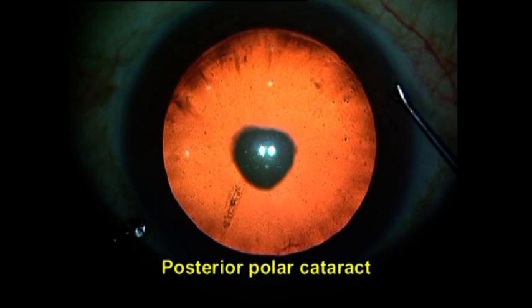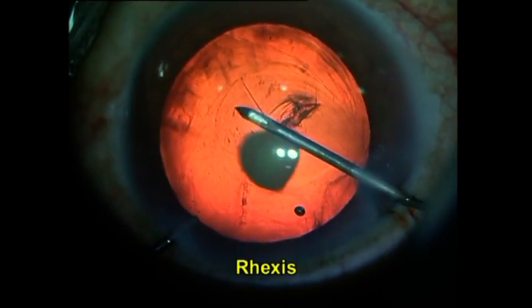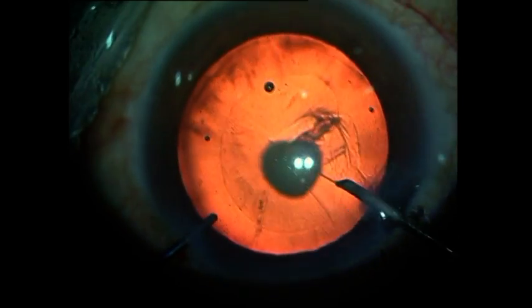The first thing to be remembered in these cases is that there is an increased risk of posterior capsular rupture, and therefore care has to be taken. The rhexis should be made as central and of an adequate size in order to be able to place the IOL in the sulcus with an optic capture in case of a posterior capsular rupture.